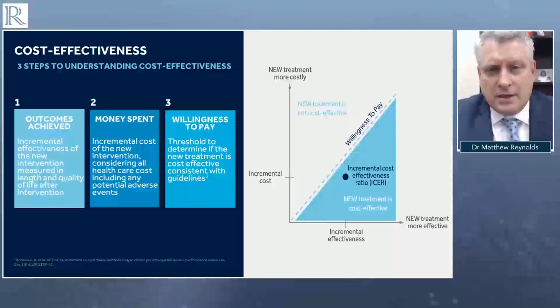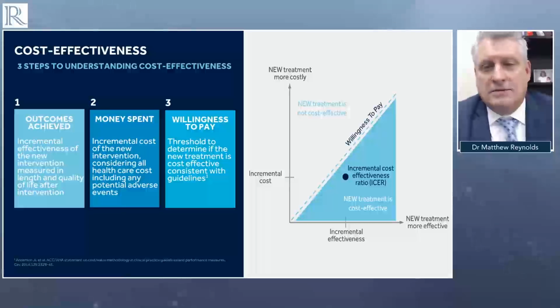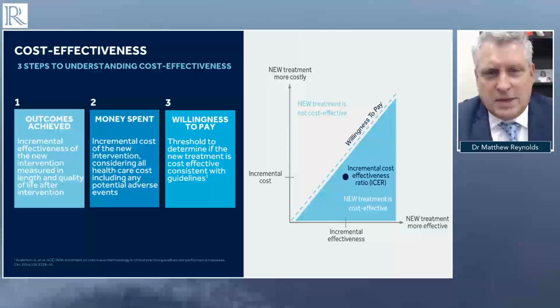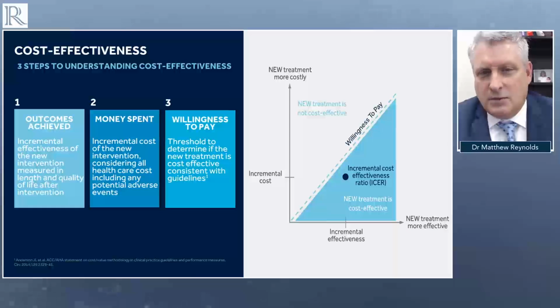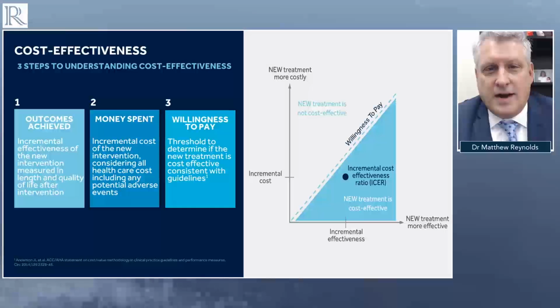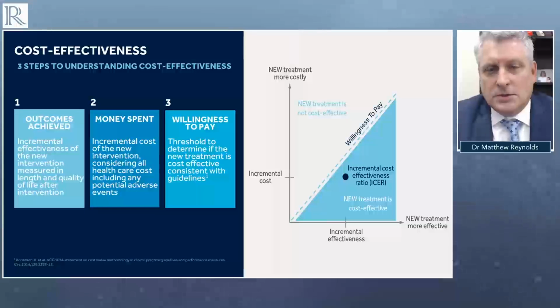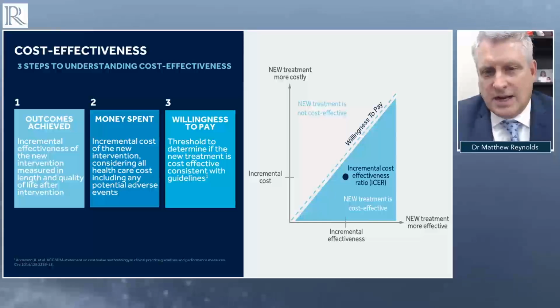When we conduct cost effectiveness studies, which I've done many times for a number of different cardiovascular technologies, there are several things that have to be measured. It's really a limited number. Although these analyses can be quite complex, all such analyses boil down to essentially three variables, one of which is provided ahead of time, and that is the so-called willingness to pay threshold. So to the right of this slide, I'm going to show you essentially what is measured in all cost effectiveness analyses.